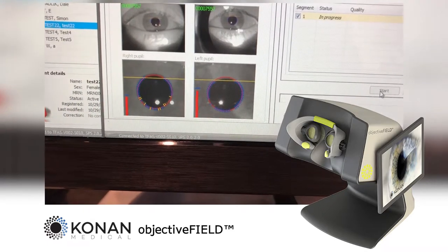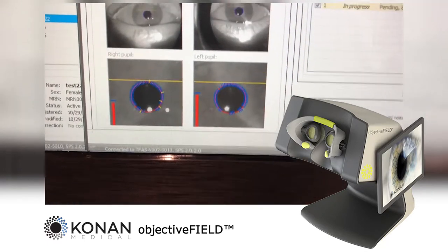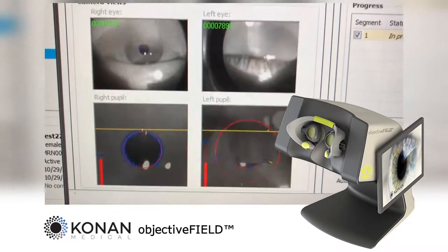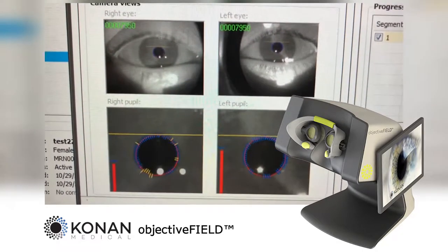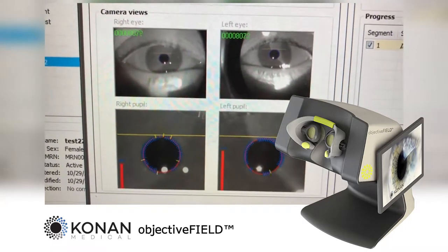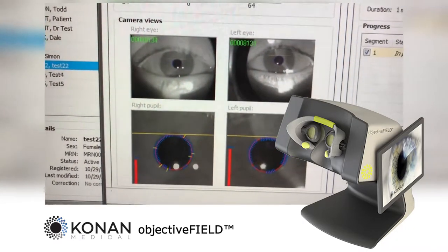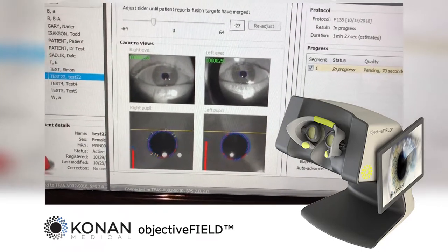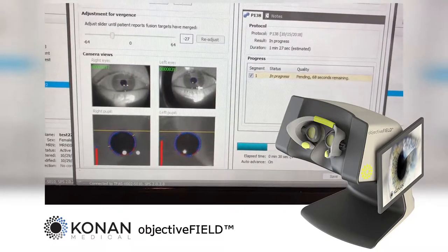Yeah, it's not really an action-packed video, is it? The patients at the end of this test aren't all wound up in knots and frustrated. So all I have to do is just look at that little red cross there. That's right. And does this have eye tracking? It does. I'm taking an image of that while we're talking.